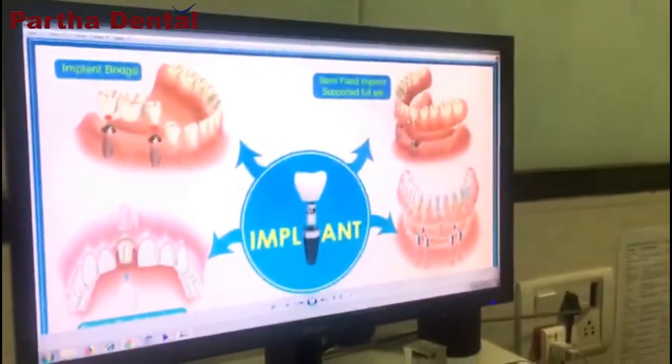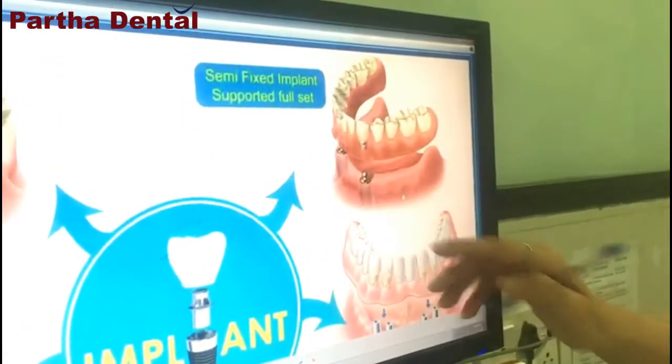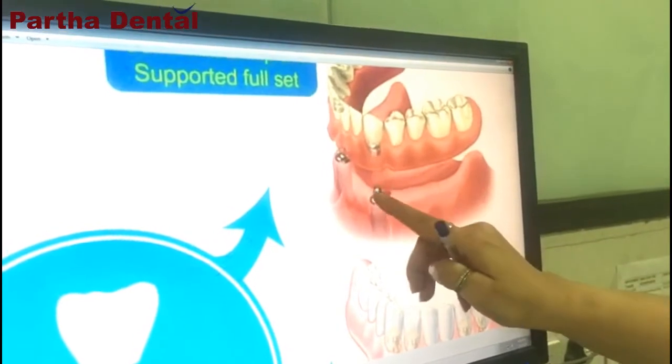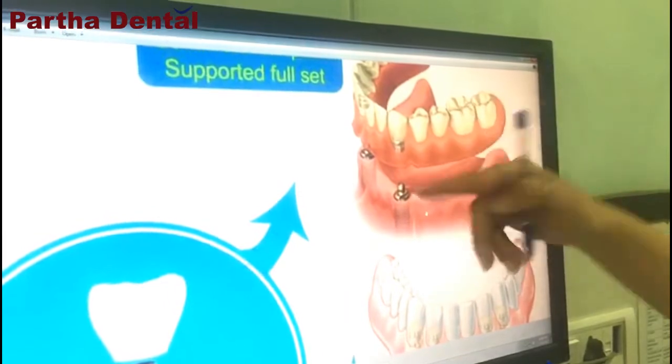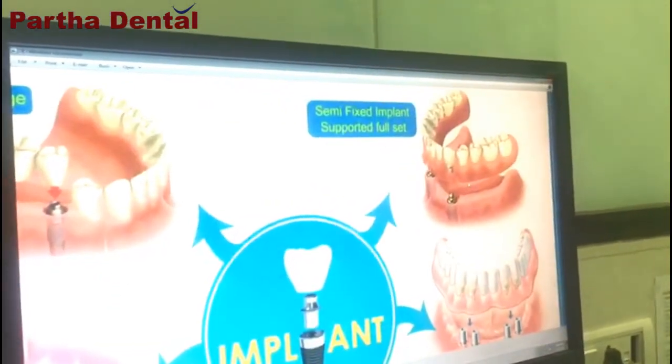The next way is making a denture placed on implants. Dentures are nothing but removable teeth — people wear them in the daytime while eating and talking, then remove them at night. Implants can be used with dentures, making them more retentive compared to the conventional type. As you can see here, this is a semi-fixed denture. Two implants are placed and the top part — the attachments — connect to the underlayer of the denture, fixing it on the implants. These dentures are more retentive, meaning they never come out while in function. With conventional dentures placed only on bone, there is a risk of them coming out while talking or moving while eating. These problems are managed by placement of two implants with attachments.